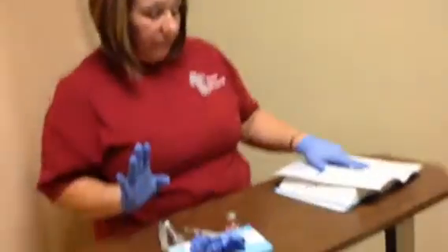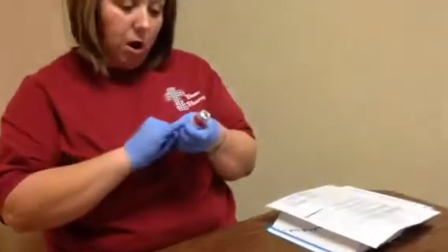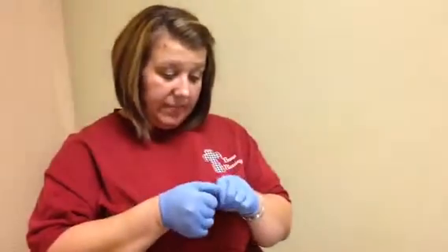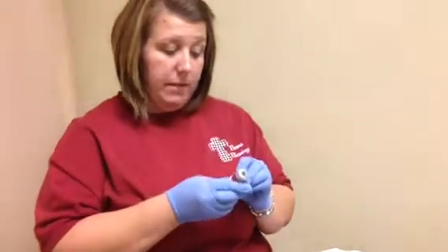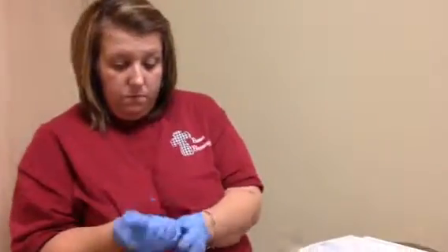The doctor's order is 50 milligrams. Let me look at my vial. I'm going to look at the name on my vial, the dose, and then my expiration date. All right. So my vial says I have Demerol 50 milligrams per milliliter. So I'm going to draw up 1 milliliter. Okay? All right. So I get my syringe and my needle.